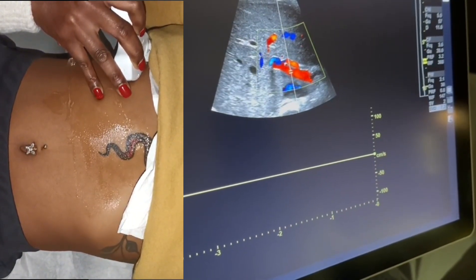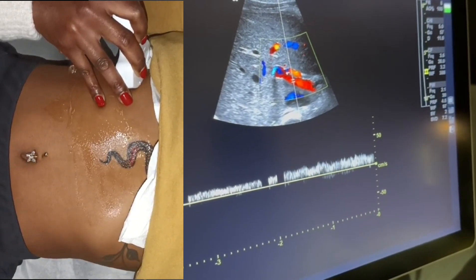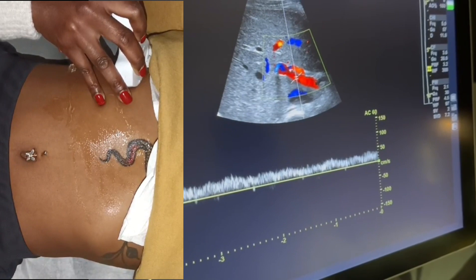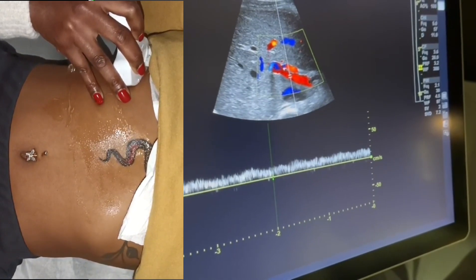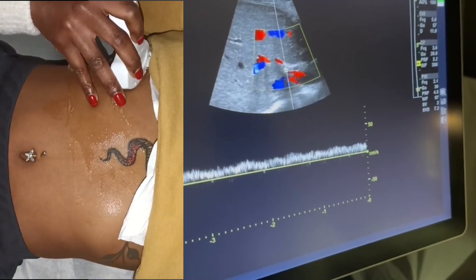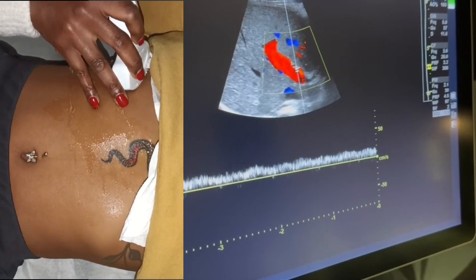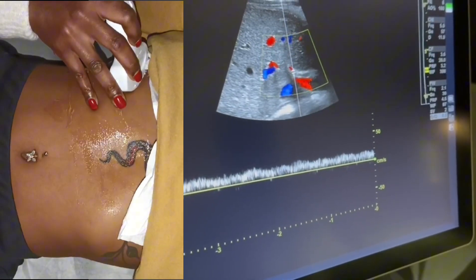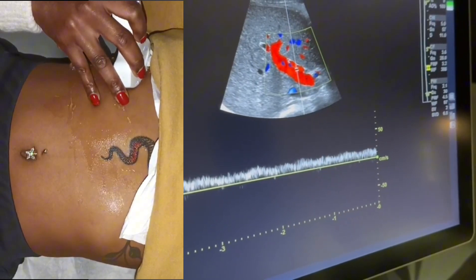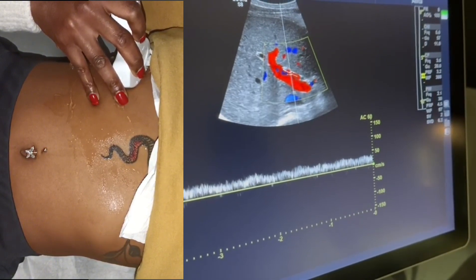For time I'm not changing angle on the portal vein image. If I decide to put an angle on it I can, but I'm taking the angle off for now. That is the main portal vein. At this point, I can also get a hepatic artery — we know the liver receives its flow from both the portal vein and the hepatic artery. I can decide to just Doppler the hepatic artery right there.